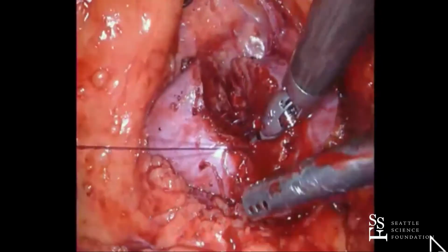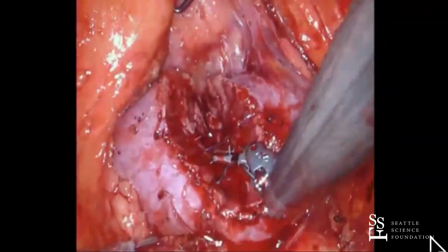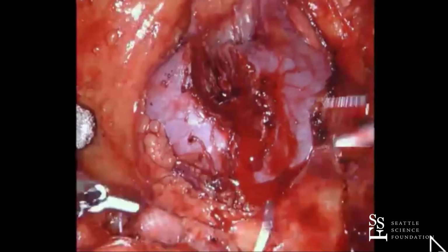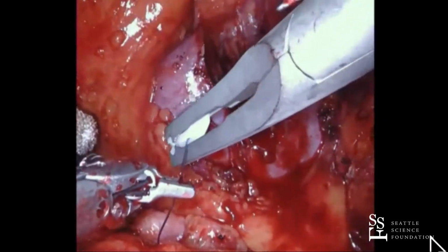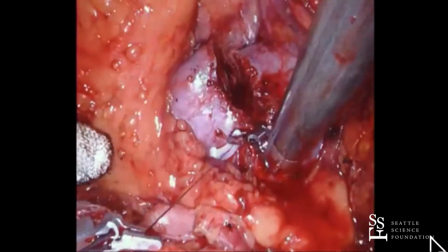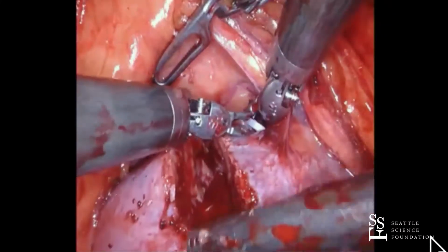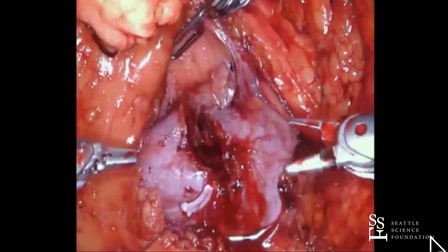Yeah. So this is almost like a three-layer closure. You did your deep stitches. Now this is just closing dead space, and then you're going to do the capsule, right? Right. That's nice. So we'll pull on that side, and then you can pull on this side because it's monofilament. Okay, let's have singles.